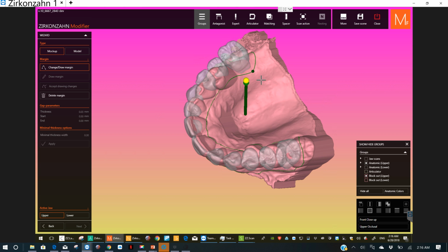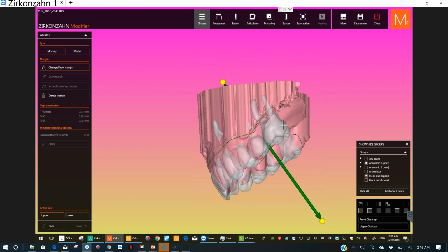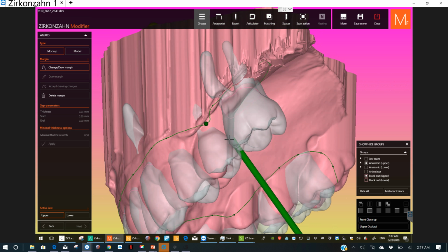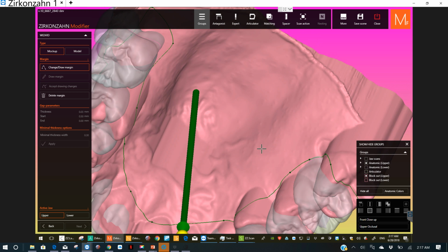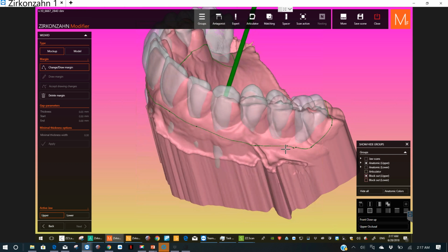You definitely want to be on the outside of the teeth. You can't be cheating in anywhere. So now I know I've got a red spot. I've got a weird spot somewhere because it's not letting me do it yet. So I'm going to keep on playing with it. Tricky margin spot somewhere.